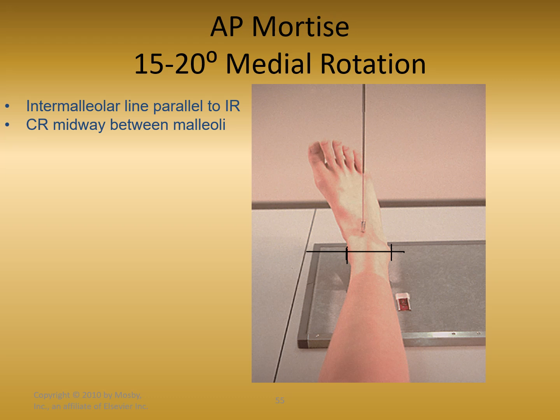If the patient were in an AP position, this would not be the case. Remember, an AP position would create a 15-degree angle at that intermalleolar line because the leg would be rotated back to vertical. The toes would be vertical like this and straight, and then we would end up with that angle between the malleoli.